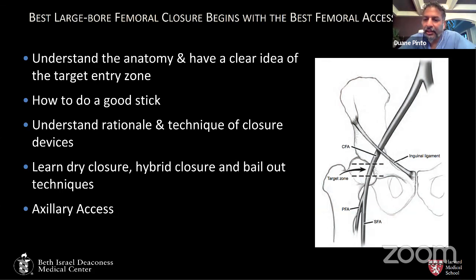And I want you to look at this cartoon here, because I've been teaching it wrong for the last 25 or so years. I've been telling everybody that you compress the artery on the femoral head, when in reality, the femoral head sits in the acetabulum, and we're actually compressing on the pubis. So if you look at the area that's called the target zone here, we're going to see that again in a few seconds, that is the portion of the common femoral artery that you want to access.